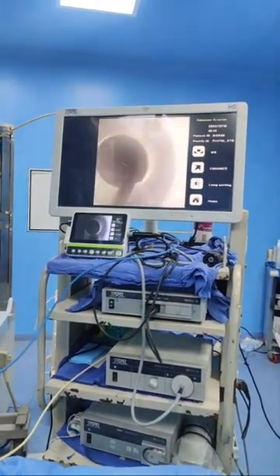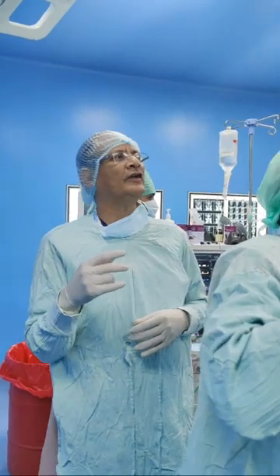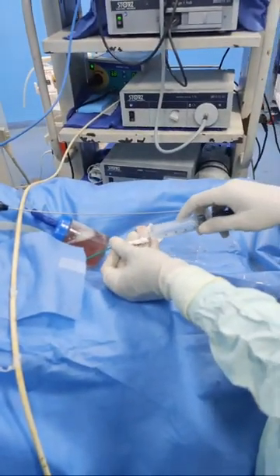This is an excellent way how we can manage the stone which has gone lower down the ureter, and by retrograde irrigation and flushing, all the fragments that had gone lower down have come out.